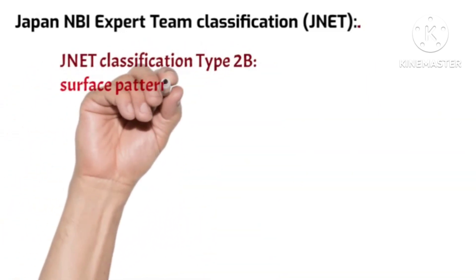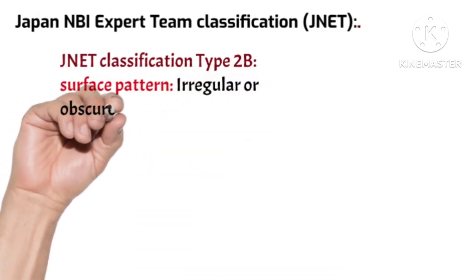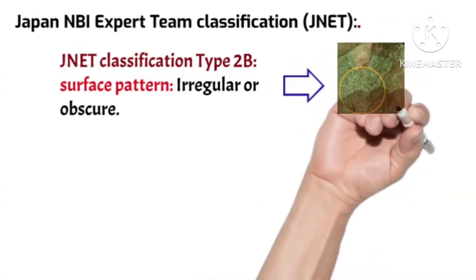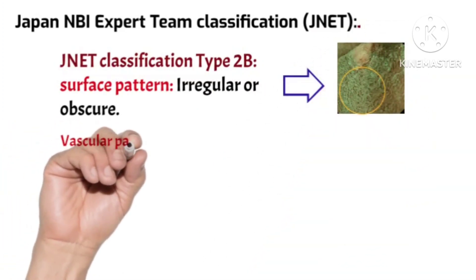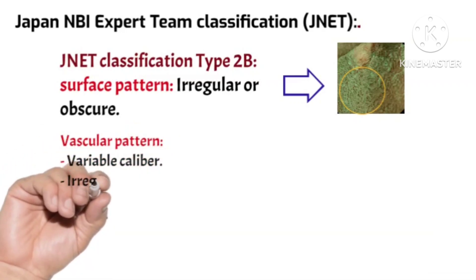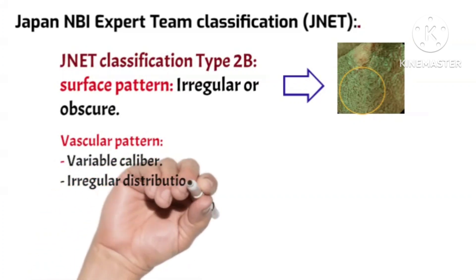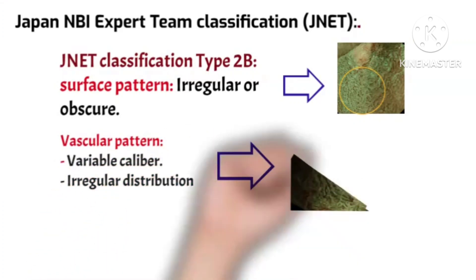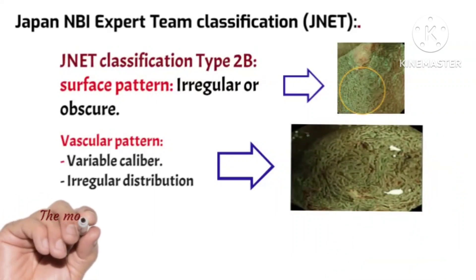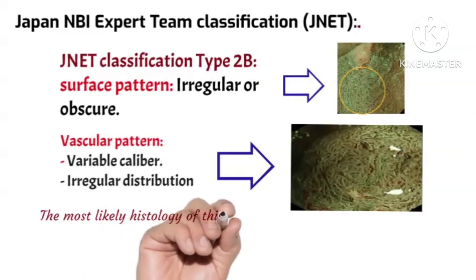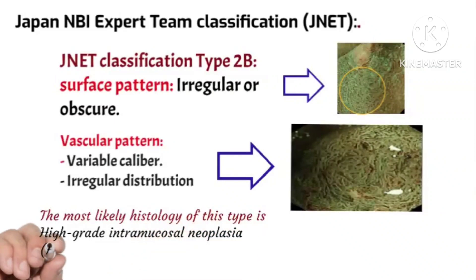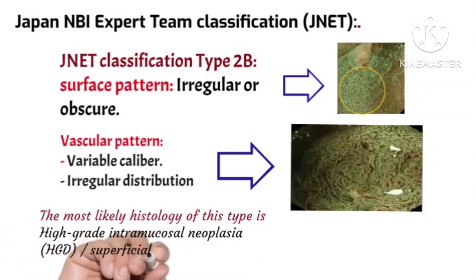JNET classification Type 2B shows a surface pattern that is irregular or obscure, and the vascular pattern shows variable caliber and irregular distribution of blood vessels. The most likely histology of this type is high-grade intramucosal neoplasia or superficial submucosal invasive cancer.